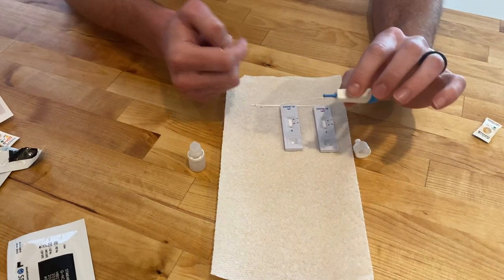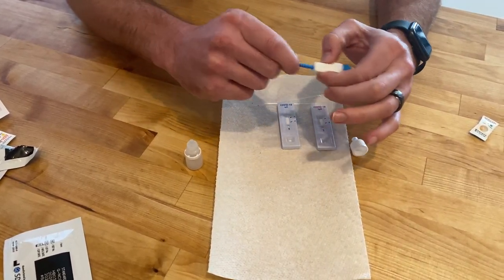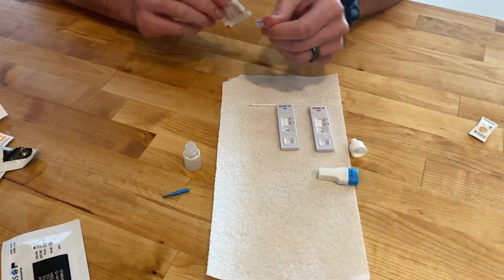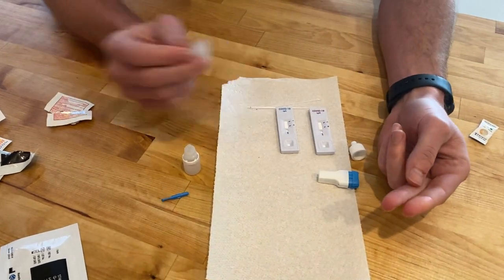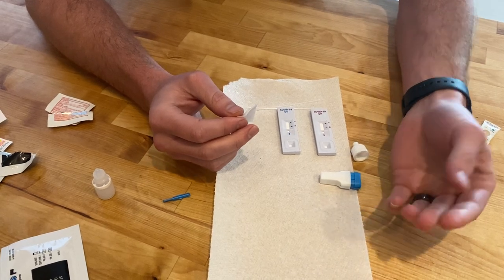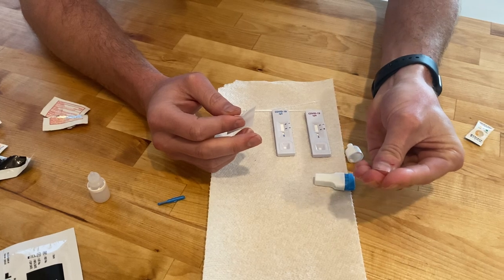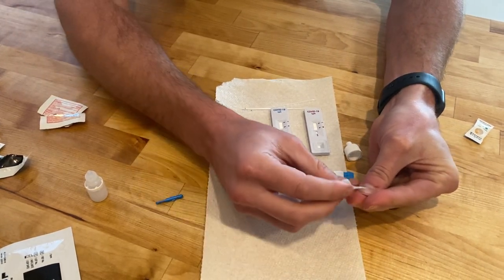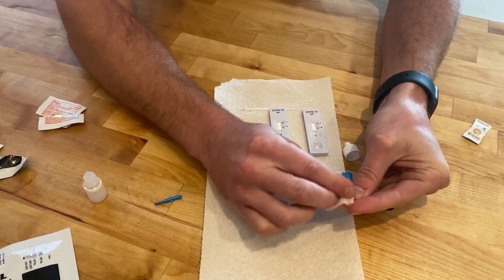You'll have your lancet device. To get this ready, there's a little tab here you need to take off — just twist and pull. Then select which finger you're going to have be the victim. The way I like to do this is to use the two fingers beside my middle finger to kind of pinch, and then use my thumb to press, so the pad of my finger kind of pushes forward.